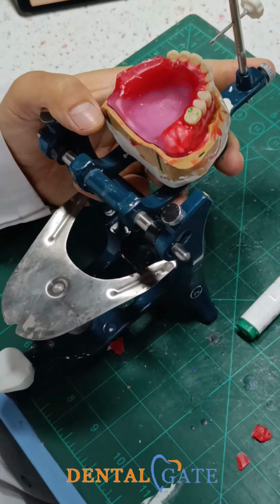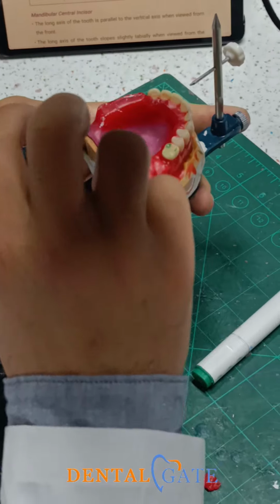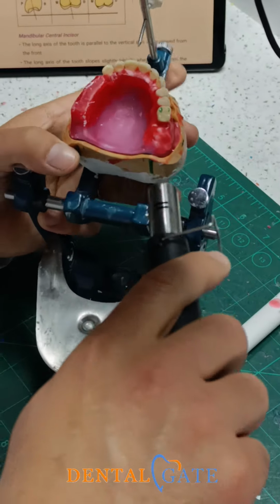Raise the heating. When you make a heating, make it to the whole of the wax. Don't make a heating here and the other part remains cold. Make it all, okay?